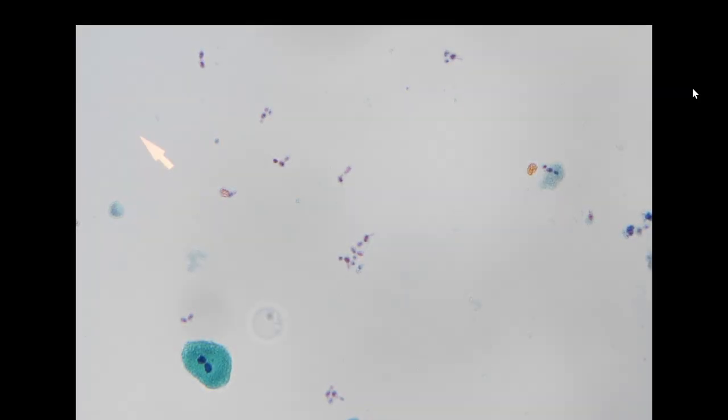And sometimes if the urine specimen has been kept at the clinical site without immediate preparation, it's very common that you can see fungus growth in the urine. So this is not coming from the patient. This is coming from the environment. So in our practice, usually we won't report fungal spores in our urine cytology specimen.